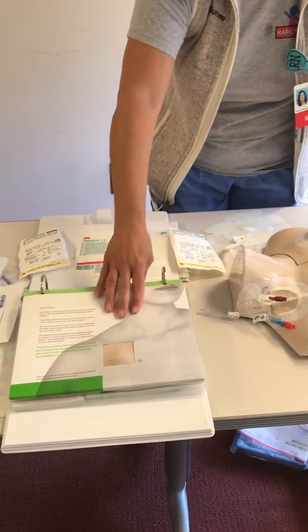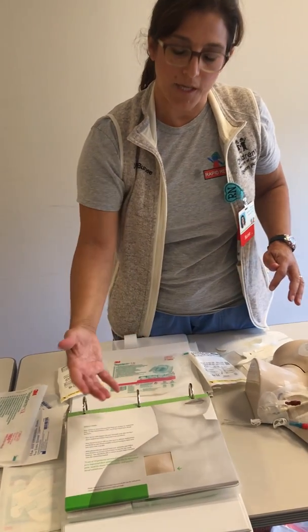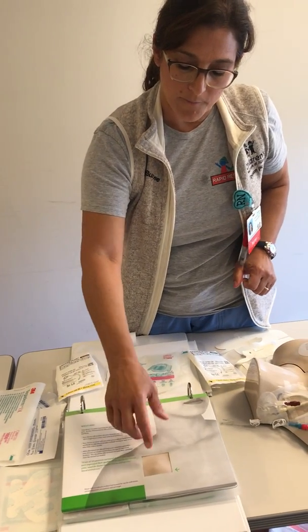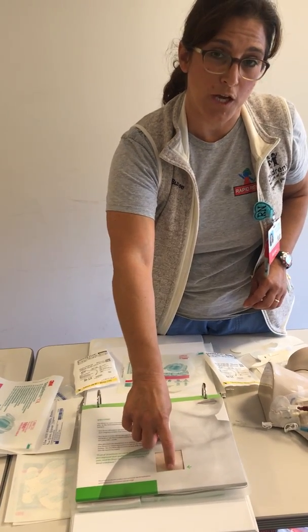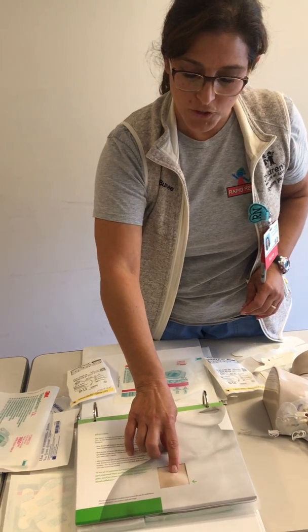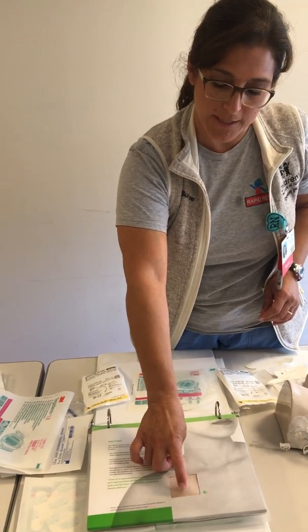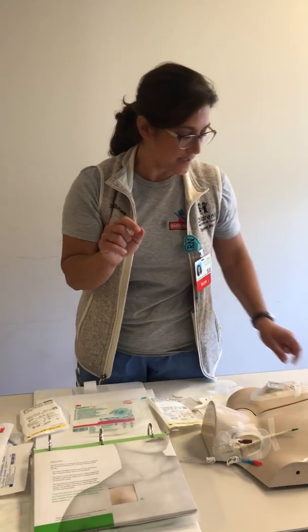The reason why you would have to know that is a power port's important if the patient's coming in and they're going to need a lot of contrast for CT scan. If you have a power port, you can use it for contrast. If you don't have a power port, you can't use it for contrast. And you want to make sure that if you're going to use it for contrast and you're going to use this power port, that you get the correct needle with the correct type of tubing.